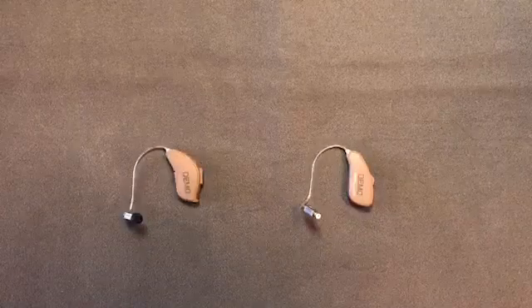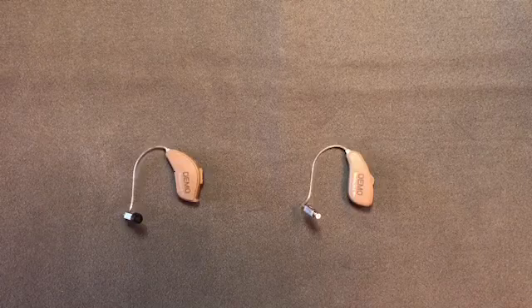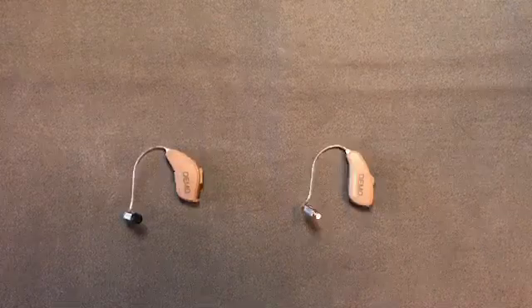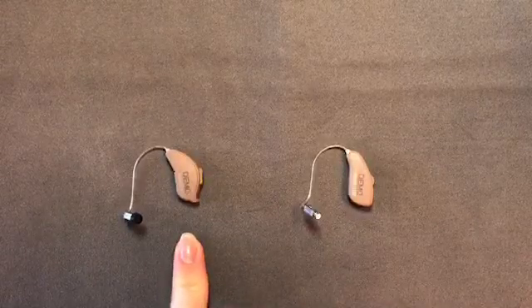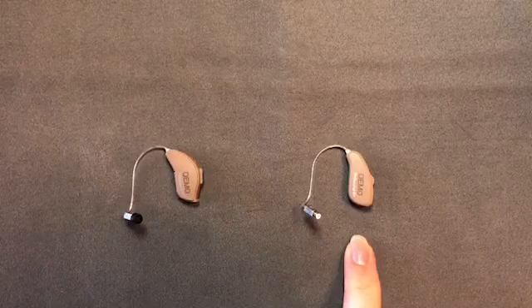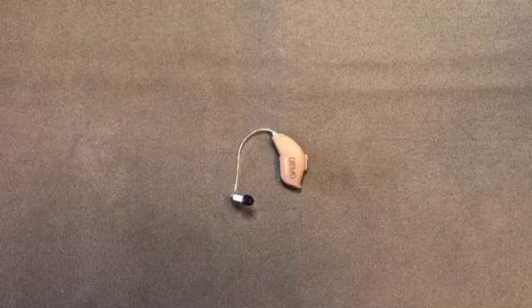Hi and thanks for joining us today. We're going to be reviewing the parts of receiver-in-the-ear style hearing aids. The device on the left has a standard disposable battery and the device on the right has a lithium-ion rechargeable battery. We'll begin with the disposable battery.